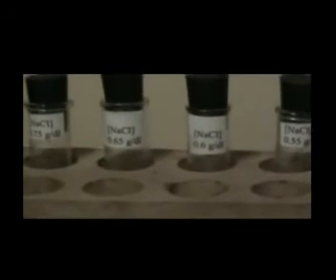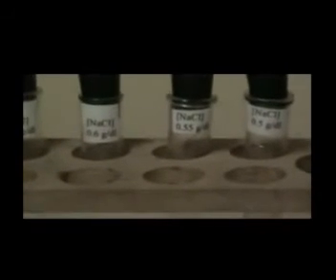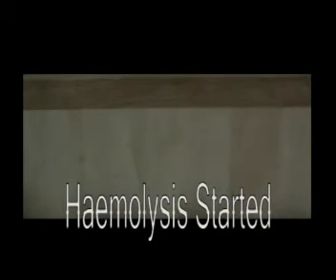The 0.9 gram per deciliter tube has a very clear solution, and the deposited red blood cells are at the bottom. The 0.75 is again very clear, with deposited cells at the bottom, and 0.65 is very clear. 0.6 is again very clear, and 0.55, you can see a reddish color in the tube compared to the previous tubes. So it's a very clear color change in the tube with 0.55 gram per deciliter.